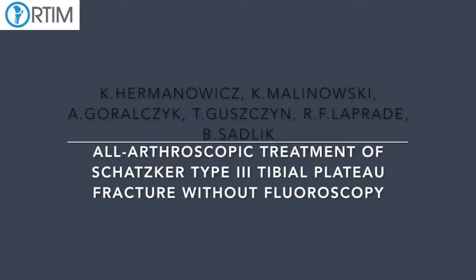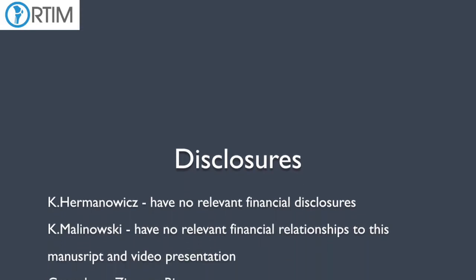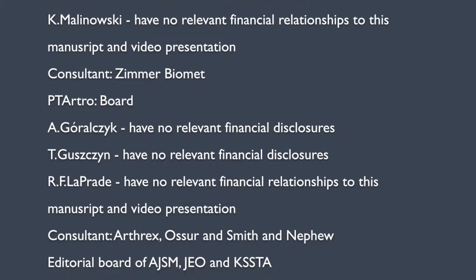In this video we are going to show you all-arthroscopic treatment of type 3 tibial plateau fracture without using fluoroscopy and hardware for fracture reduction and stabilization.